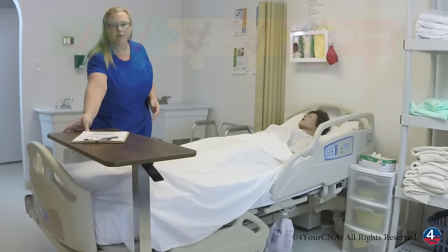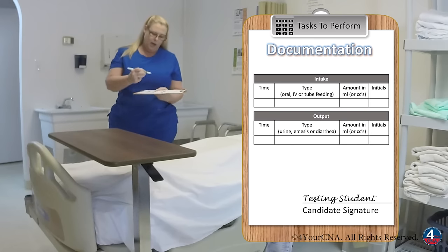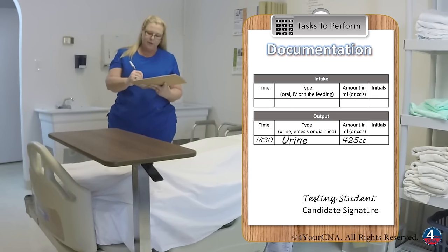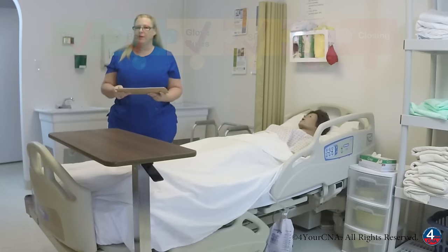After washing my hands, I'll document on the intake and output sheet that the evaluator gives me. I'm going to document the time of output, the type of output, which is urine, the amount of output in cc's, and my initials. After documenting, I'll review the steps of my skill, make any corrections, and then tell the evaluator my skill is done.